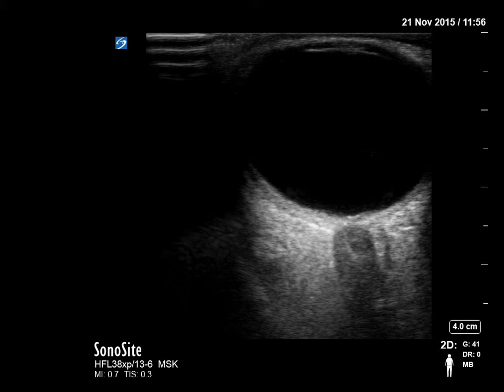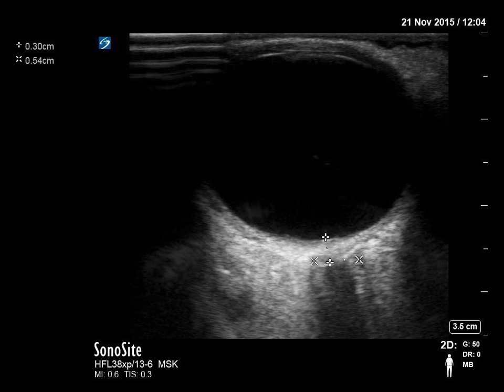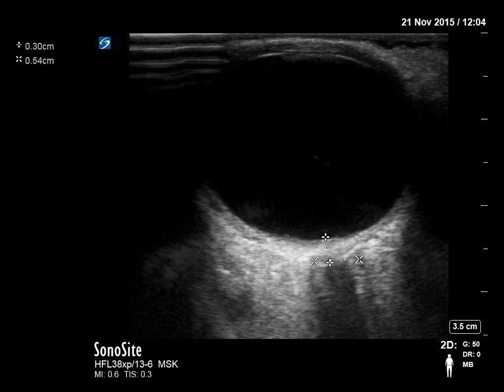Optic nerve and optic nerve sheath — you can see it very clearly, there is a clear delineation. Inside the sheath is where you measure. The measurement shown is 0.3 centimeters or 3 millimeters — this means you take the optic nerve sheath diameter at 3 millimeters below the origin of the optic nerve. That is the consensus. The next measurement shown in the left upper corner is 0.54 — so this is the diameter at 0.3 centimeters below the origin of the optic nerve.